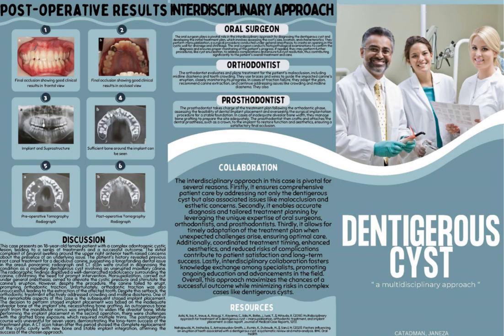Long-term results: the patient had an uneventful postoperative course for 7 years. A CT scan taken at this point showed that the cystic cavity had been replaced by new bone, and the implant remained stable in the surrounding bone. The case involved the collaboration of multiple specialists.